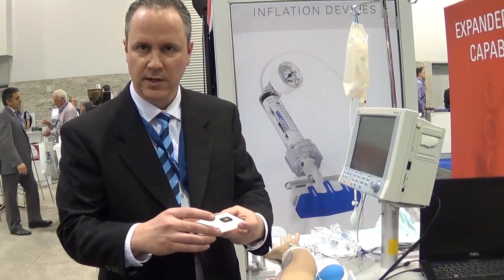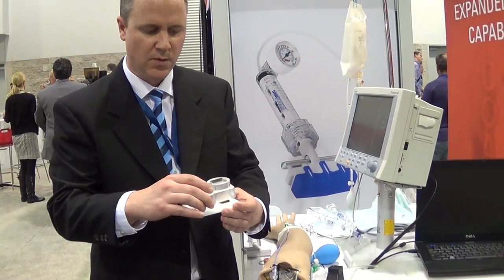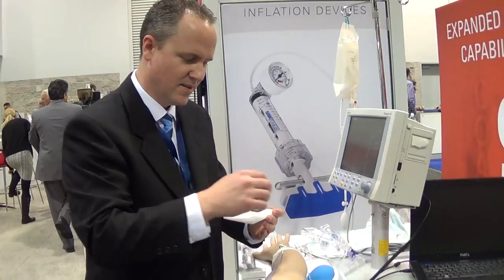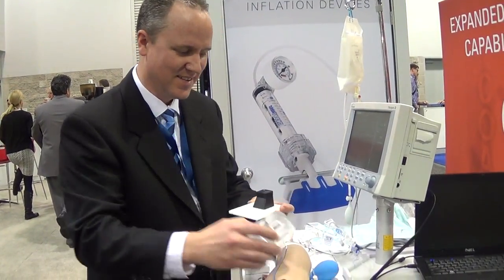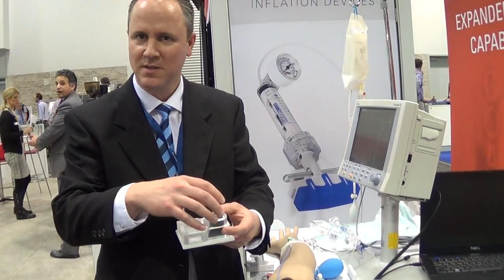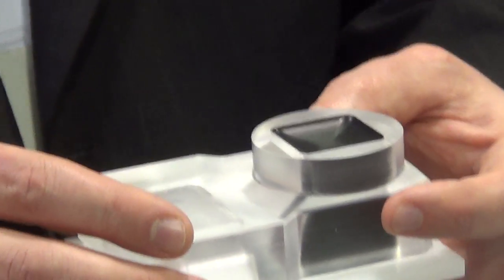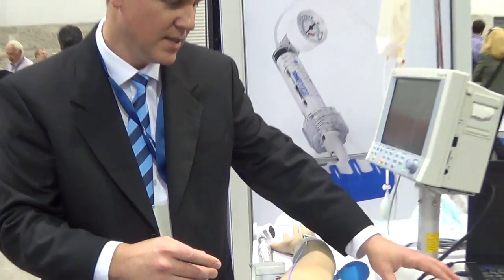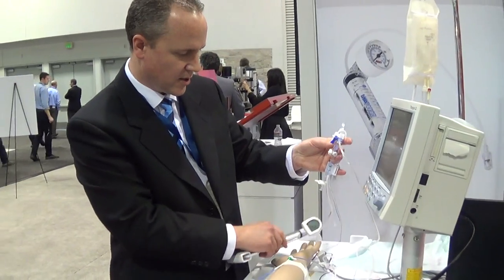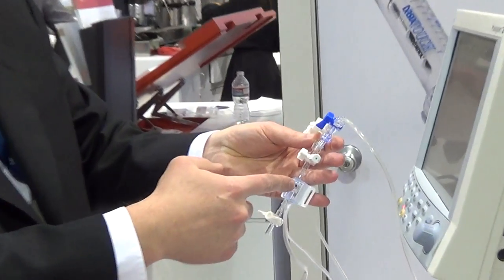We mount that sensing element carefully onto a ceramic substrate, then we put the polycarbonate snout over the top of it — you can't do it in that order. After the polycarbonate snout is on top, we fill this area with a dielectric gel to protect and insulate the sensing element. This sensing element is shown here, and the sensing element is inside this housing right here.